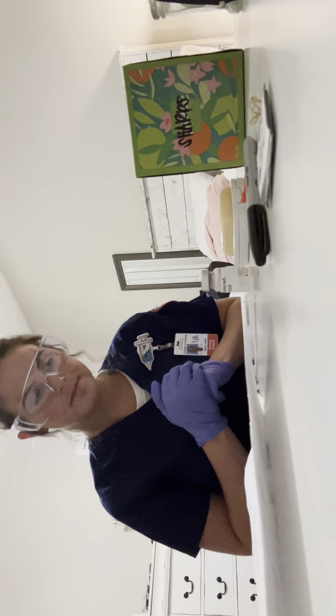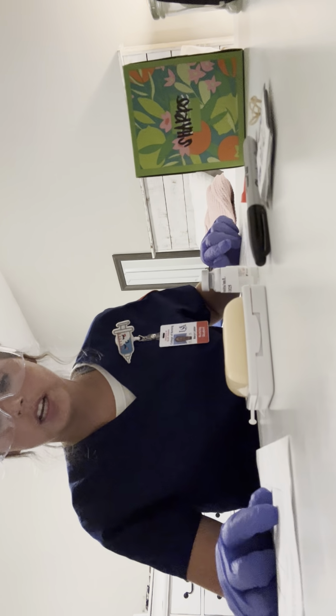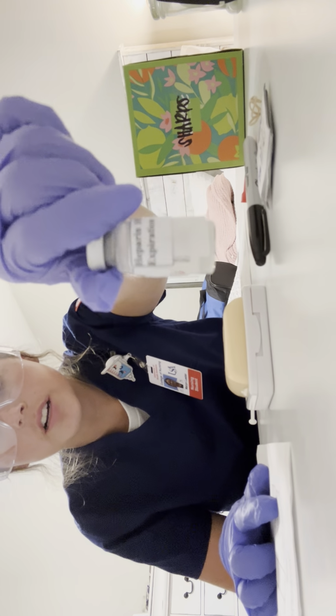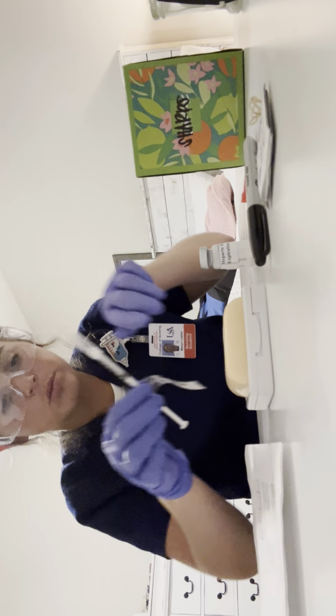So that was the right patient. Right medication is heparin, and we see we have heparin right here. And we know that we have heparin drawn up in our syringe.